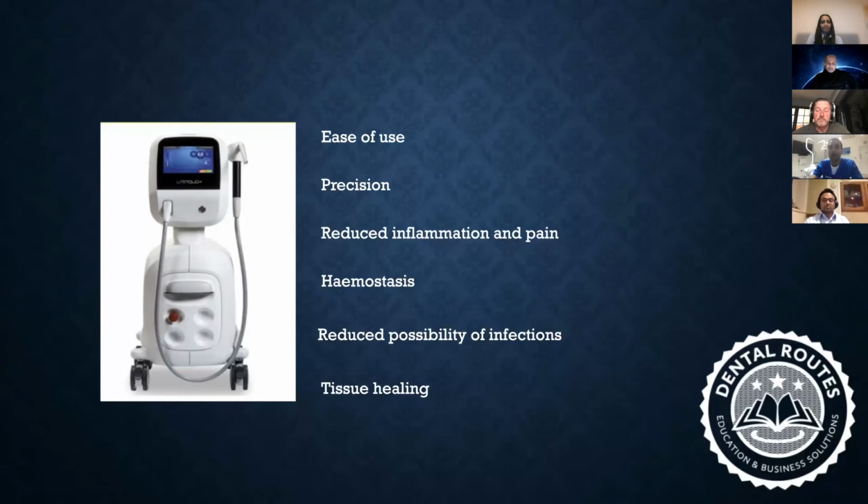In post-implant surgery reviews, in my own cases, I have seen very limited signs of inflammation, and patients reinforce this, saying how little discomfort was present post-surgery. Bleeding is always a concern post-surgical treatment.